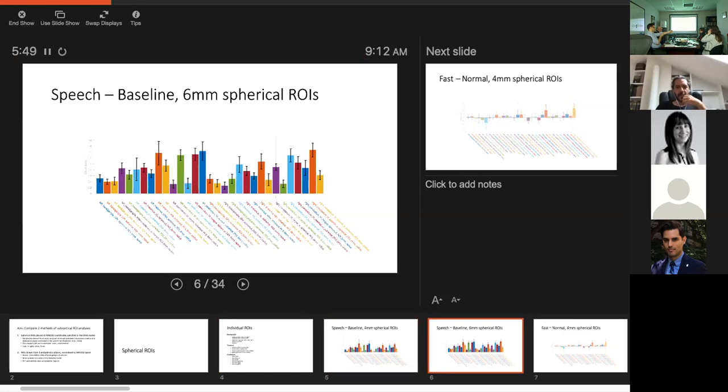Okay, awesome. Thanks. I think when you're doing something like this, where it's defined in an atlas, the smoothing is probably the way to go. Because if we're doing ROI analysis where we're defining, Alfonso, before I go on, do you agree with that? Yeah, I agree. For spherical ROIs, the border of the sphere is not all that meaningful or representative, and you don't care if you smooth a little bit across that border.